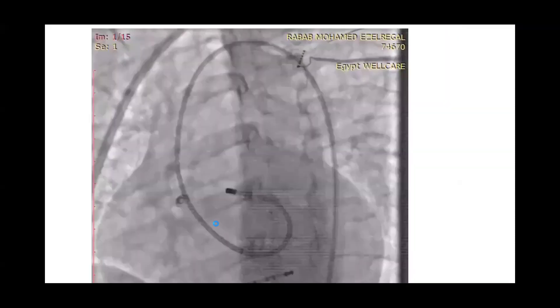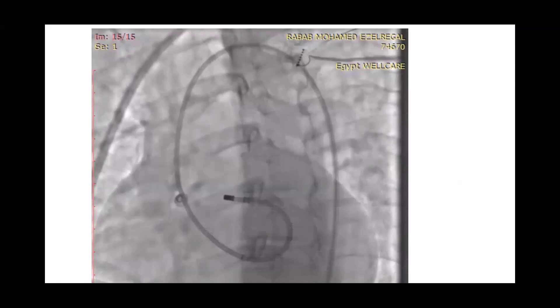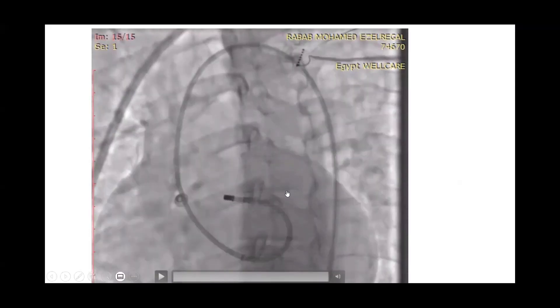Here is a fluoroscopy video. We entered the RVOT and started viewing the map, guided by the 3D electro-anatomical mapping system CARTO. Here, the team was performing mapping in the left coronary cusp, trying to obtain the earliest local activation time relative to the QRS complex.